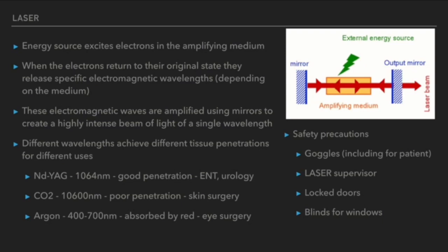It gets to the patient through a fiber optic cable, which has a whole bunch of physics within it itself. And one of the questions that they like to ask about laser is what safety precautions and what things can go wrong with laser. Basically, it's very safe, provided that the fiber optic cable is still intact. If the fiber optic cable breaks, it is just glass. If it breaks, then laser beams can go all over the place, which then causes issues.